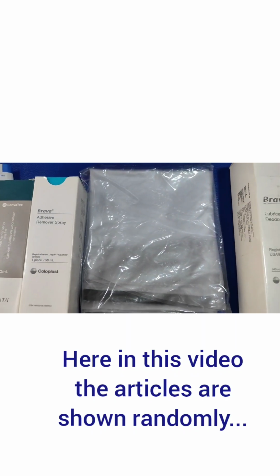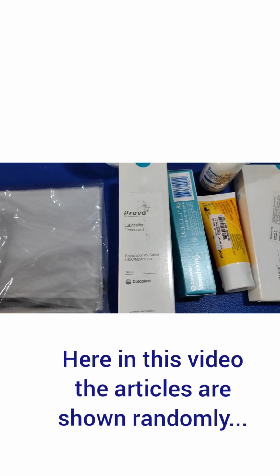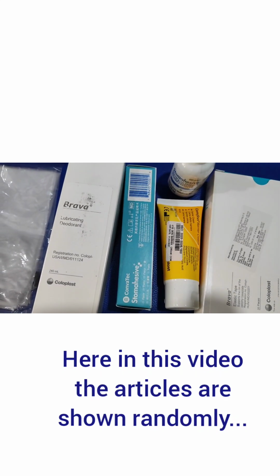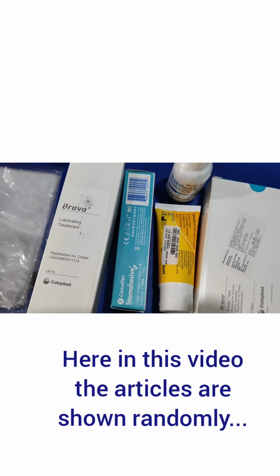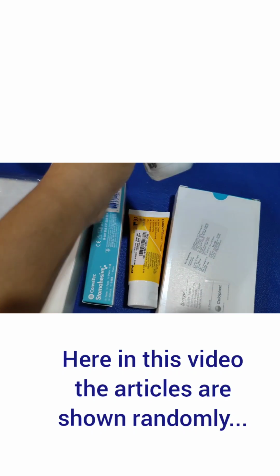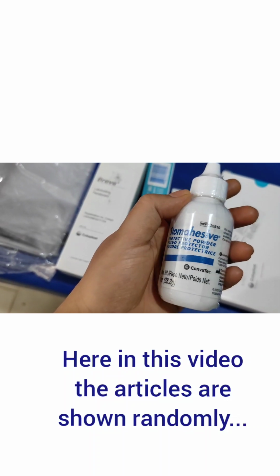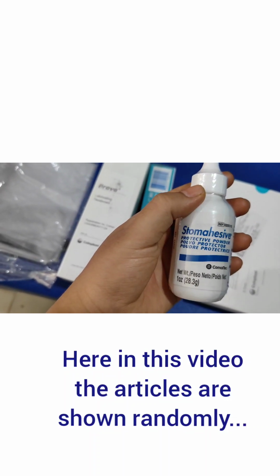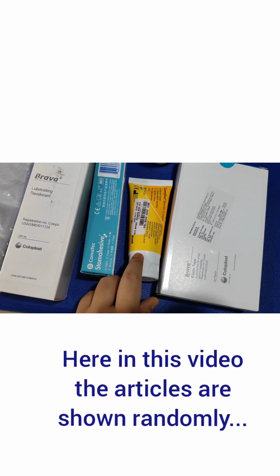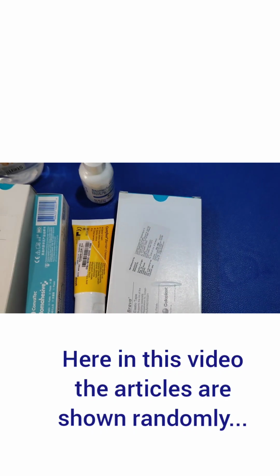You should remember that stoma care is not a sterile procedure, because the patients, after returning back home with a stoma, the attendant of the patient or the patient himself or herself can do this stoma care, right? So here the nurses or the doctors will teach the stoma dressing and caring to the patients, and accordingly they can change their bag. Then mild soap and warm water, in home settings they can use, for removing the gauze piece and the bag, but in case of hospital settings, normal saline is preferably used.